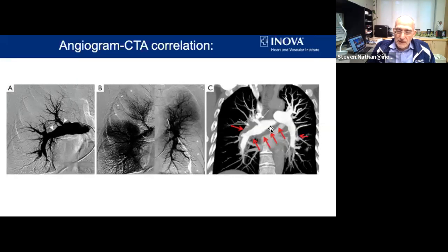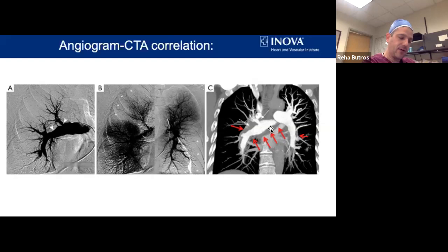Typically when we get CTs in the ILD patients, it's high-res CTs without contrast. Could we combine these, perhaps, with when we get a high-res CT for interstitial lung disease? I'm not really sure if you would have to scan again, prior to giving contrast, to do the high resolution and then do the dual energy CT.